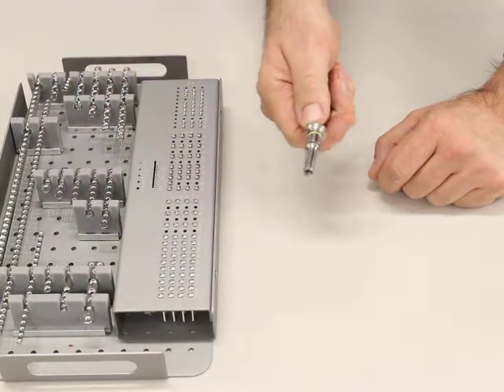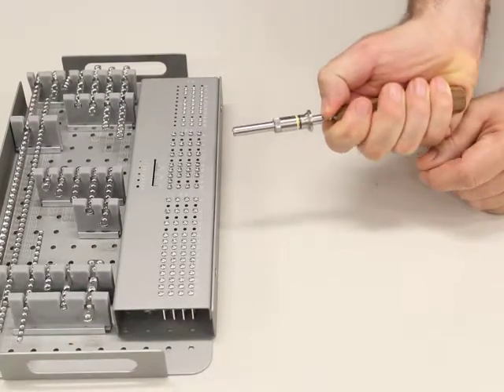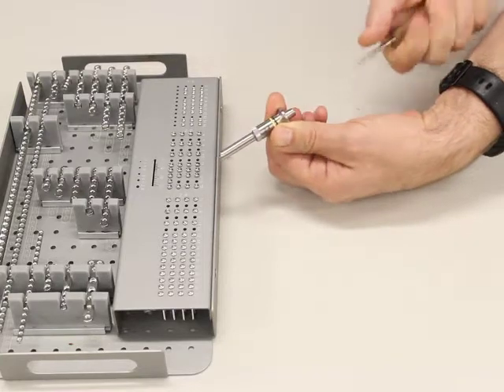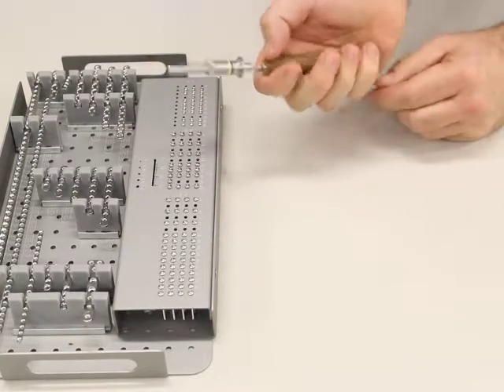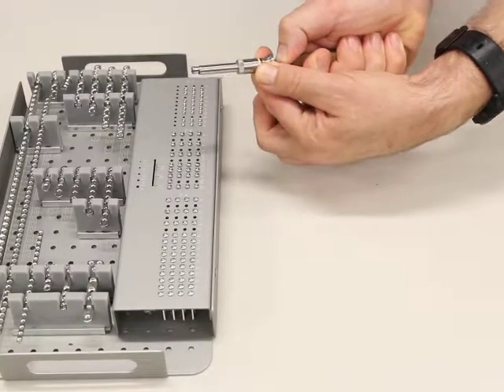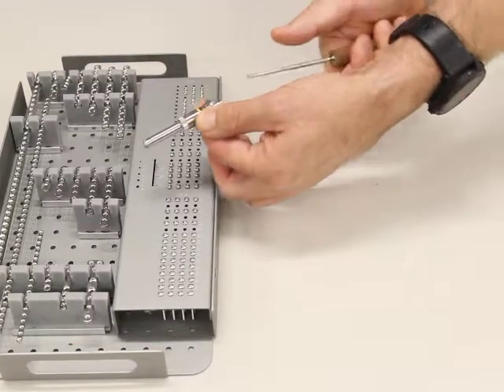To get this back off again, you just put your thumb here, push back against there, and push it off. To show that again: put your thumb behind the spring-loaded bit here, pull the sleeve back against your thumb, and then push all of it off.